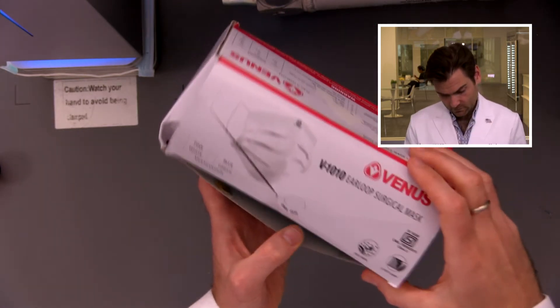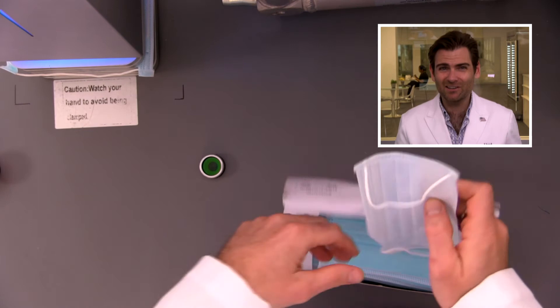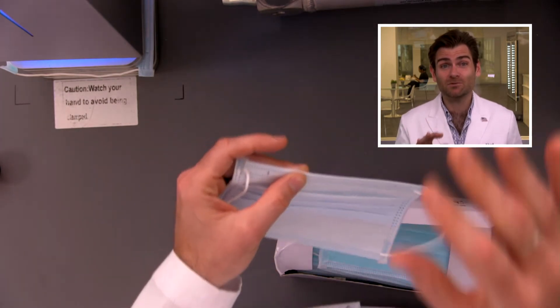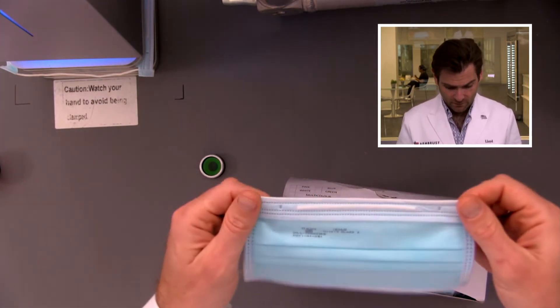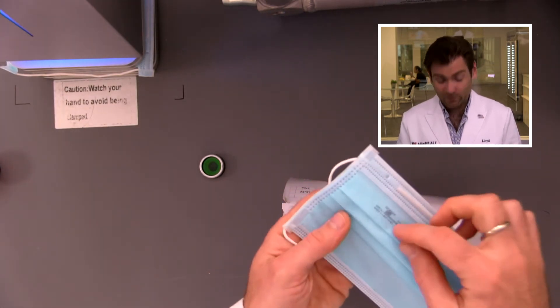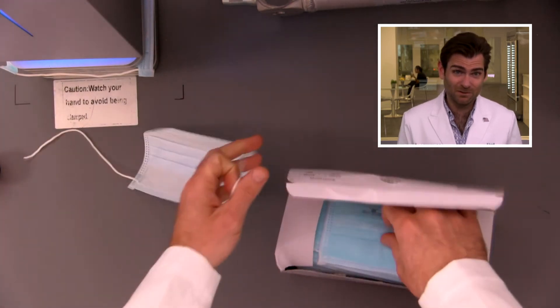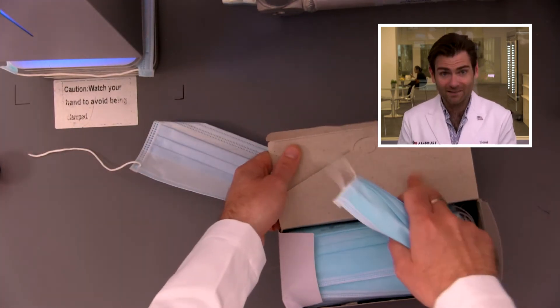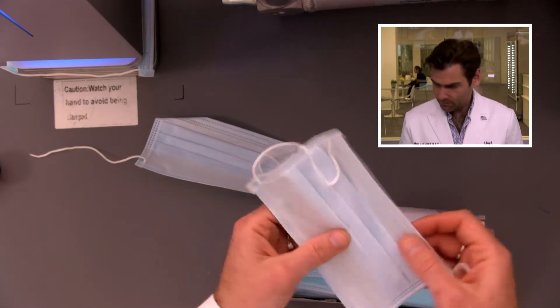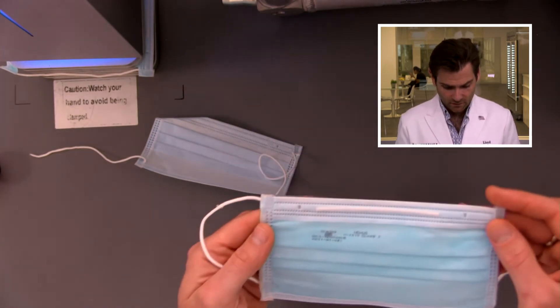Let's open the box. Their claim isn't really making a claim according to this machine, so I think it's a little disingenuous. Different cultural thing — but when talking about COVID, we need to see probably 90% or better. They're printing right on this, which I've seen a lot in India — they're actually putting the lot number on there, which is great. This is a nice fold-over, which typically makes the elliptical shape. I don't love that the box is just flopping around. I can see through the melt-blown — the spun bond is ridiculously nice quality, some of the best I've seen.